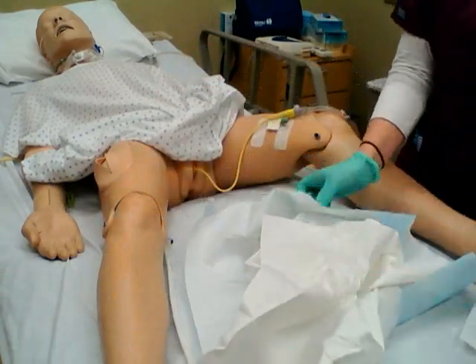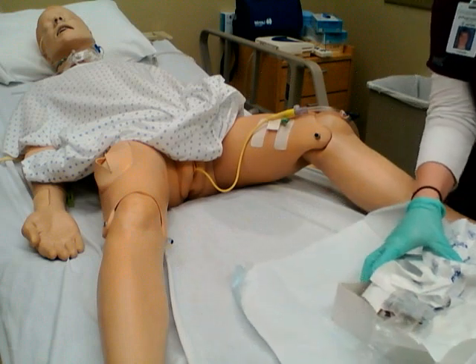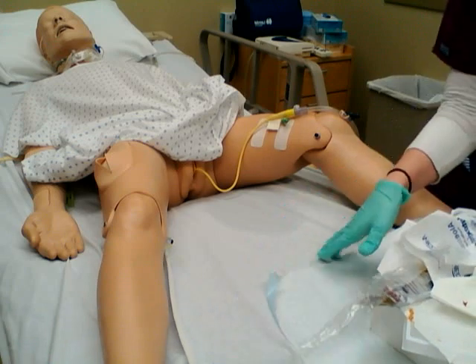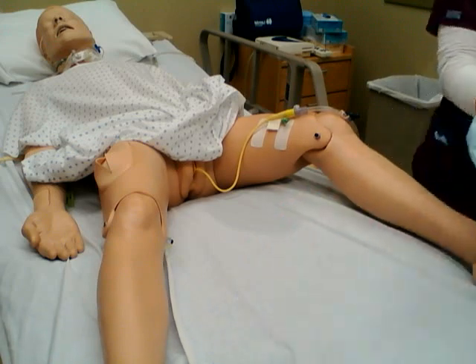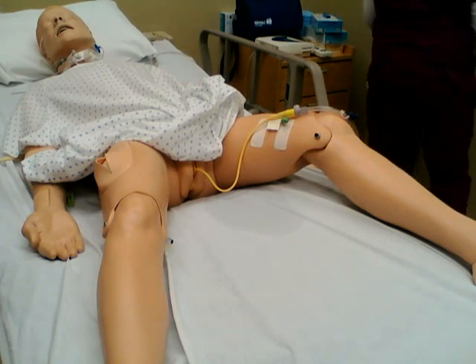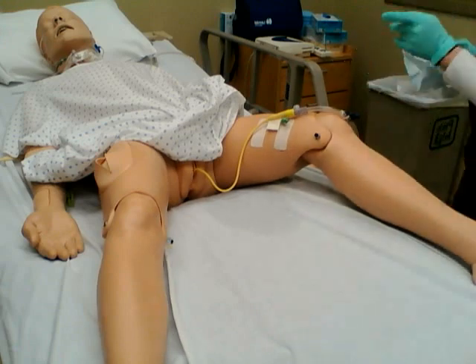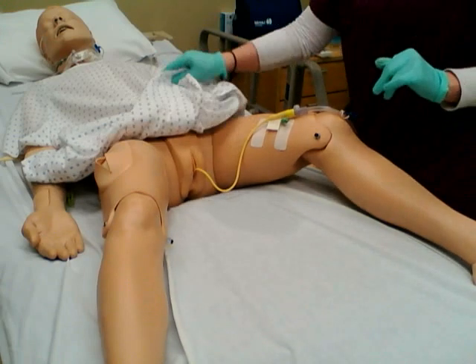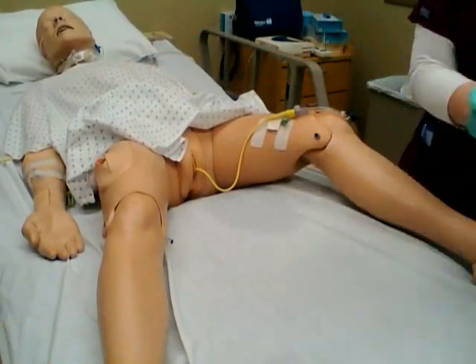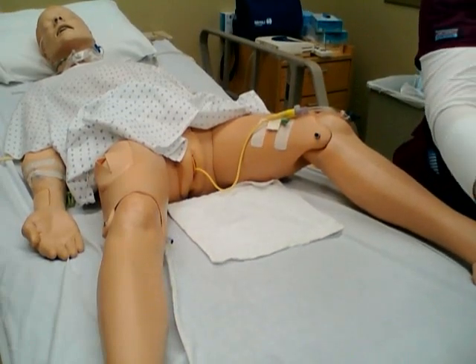Now the lab has called, or not, for the sake of the video validation, the lab has called and we will be getting a specimen for the lab. So I'm going to re-uncover the patient again. You want to have your lab products ready.